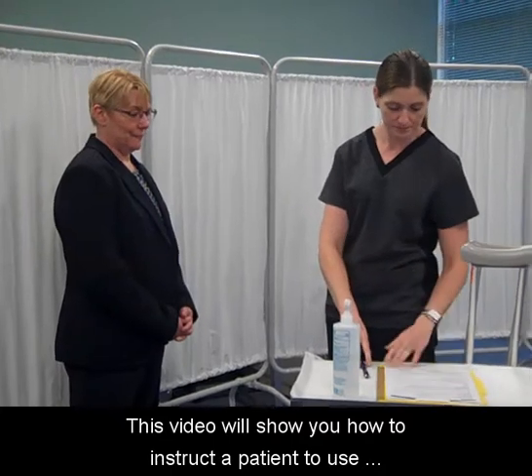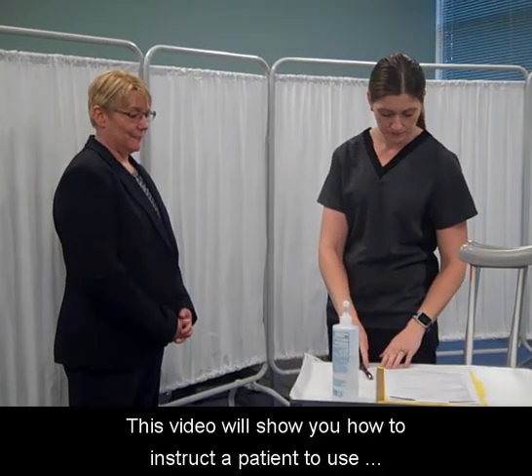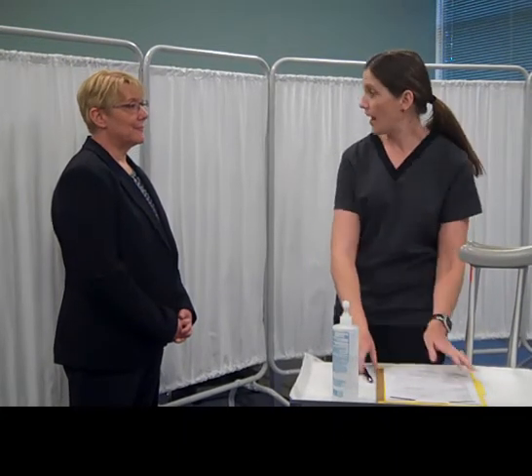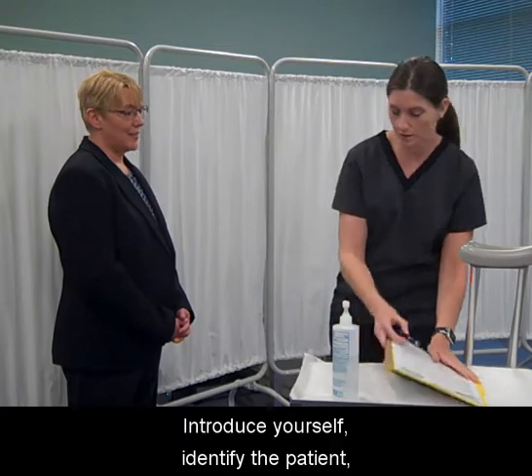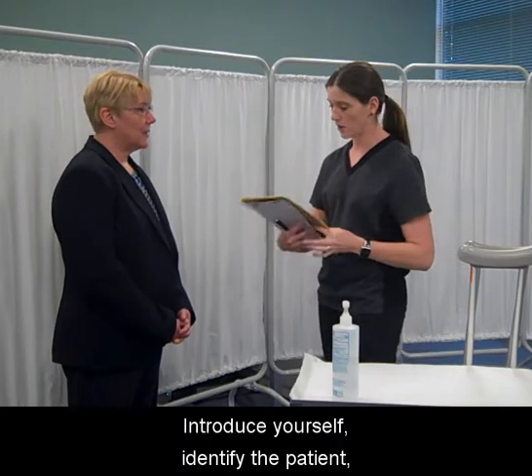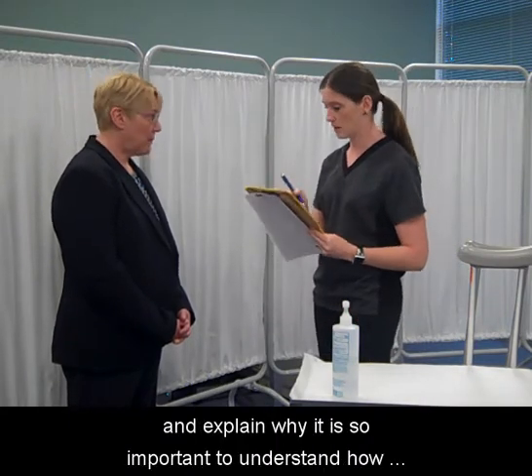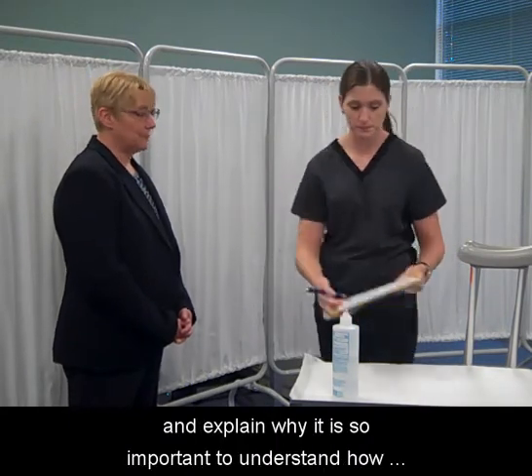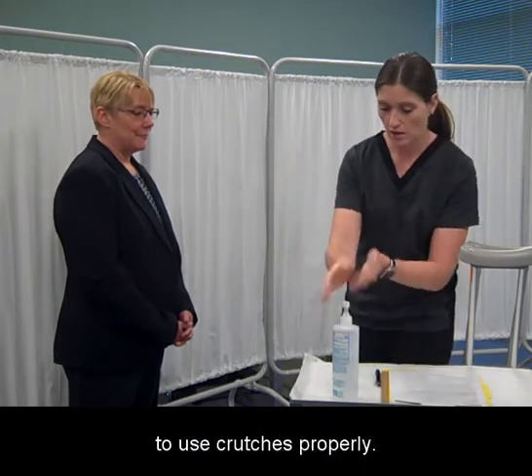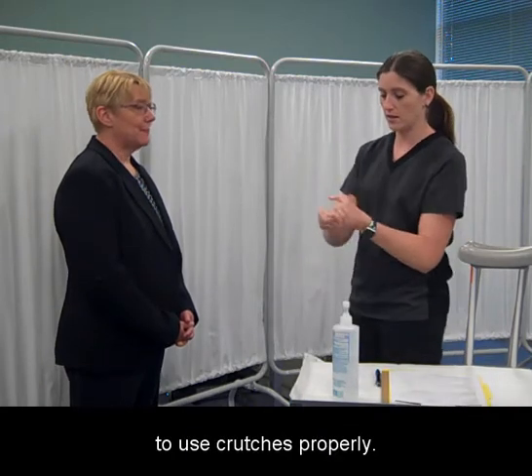This video will show you how to instruct a patient to use crutches properly. Introduce yourself, identify the patient, and explain why it is so important to understand how to use crutches properly.